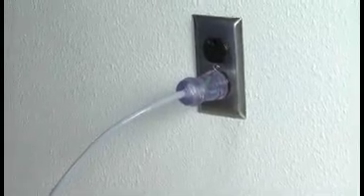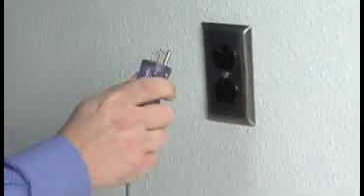If the plug blades or ground pin are bent or damaged, or if you are in doubt as to the safety of the cord, the cord should be replaced.